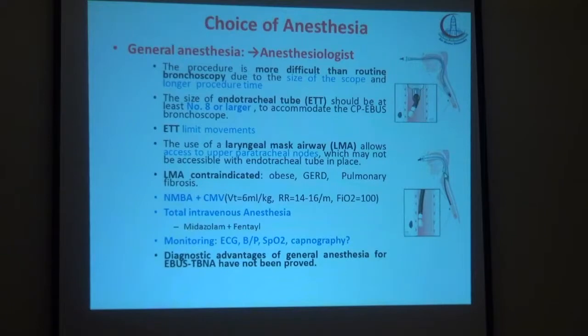العيان اللي جنرال انستيزيا هي مسؤوليه الانستيزيولوجيست، ودي ظريفه ان انت لما بتعمل منظار وبتعمله اندر جنرال انستيزيا، بتشيل من راحتك ان انت مسؤوليه الاير واي والمشاكل اللي ممكن تحصل اثناء البروسيدر. بيبقى انت بتركز في المنظار بس، ودي بتبقى ميزه ان الانستيزيولوجيست بيشيل الشيله.